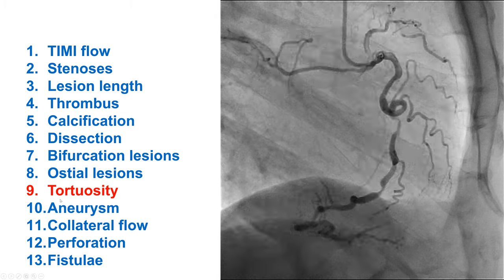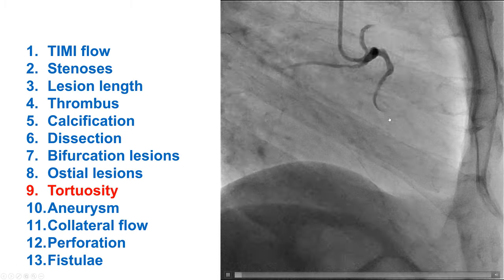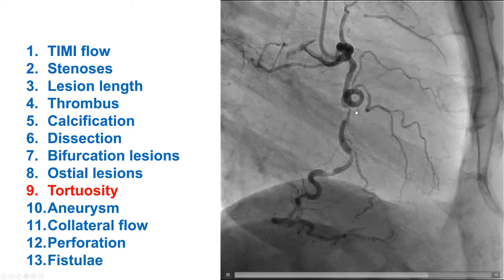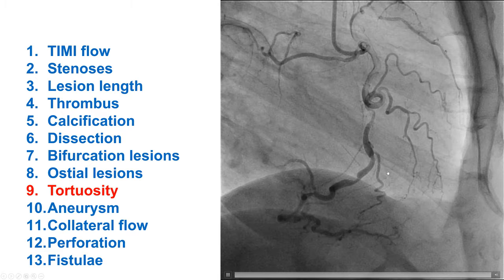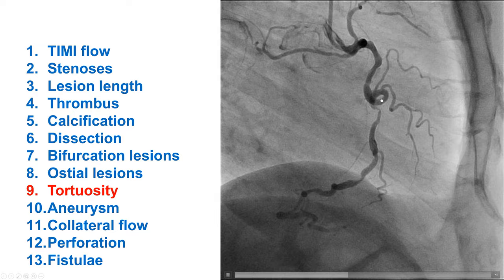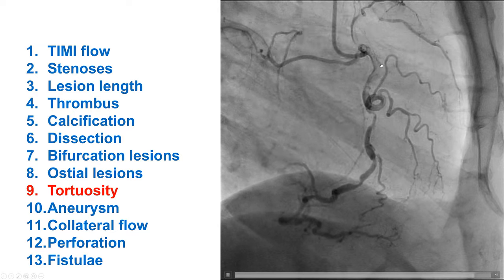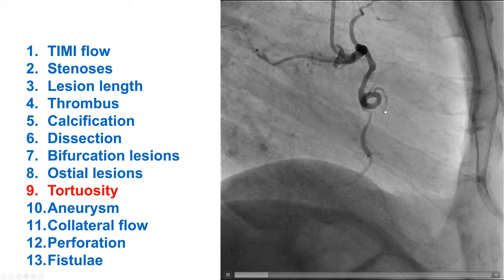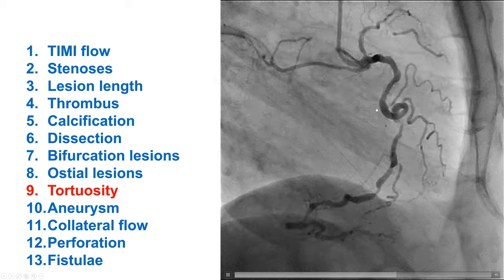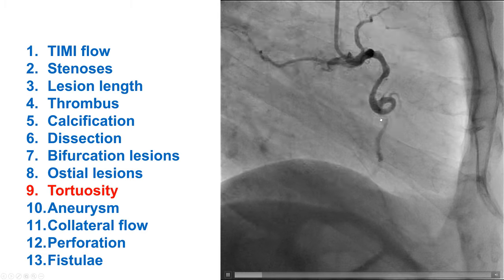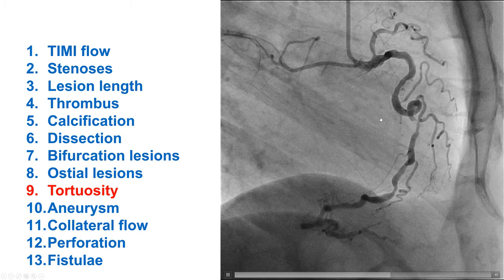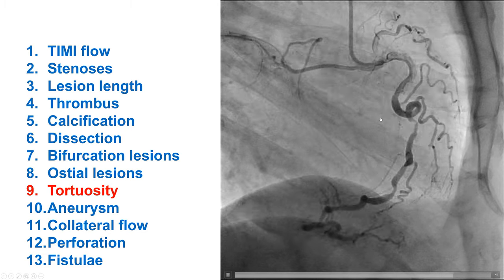Characteristic number nine is tortuosity, which refers to the presence of bends in the coronary artery. This is an example of extreme tortuosity with multiple bends. These lesions can be challenging to wire and deliver equipment to, and this will be discussed in more detail in Chapters 8 and 9.